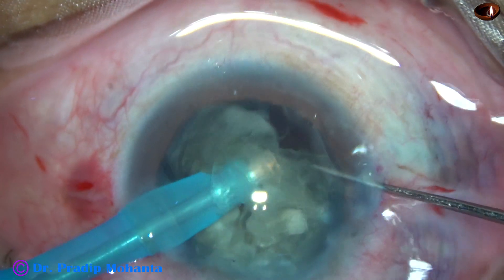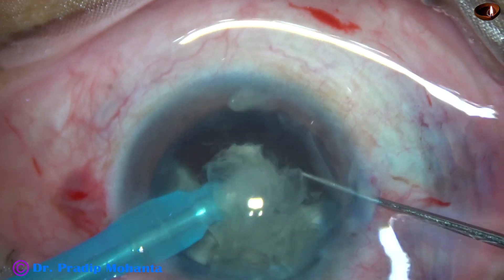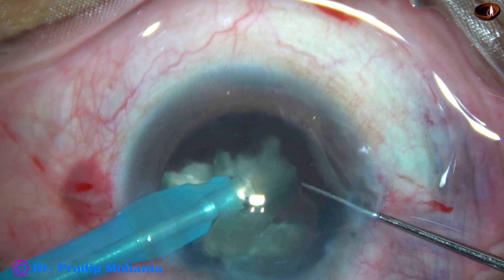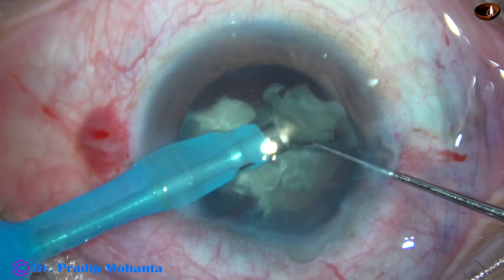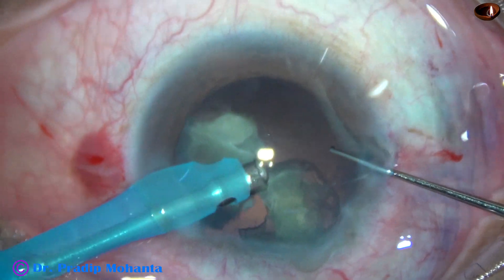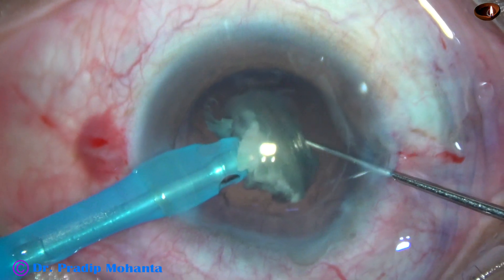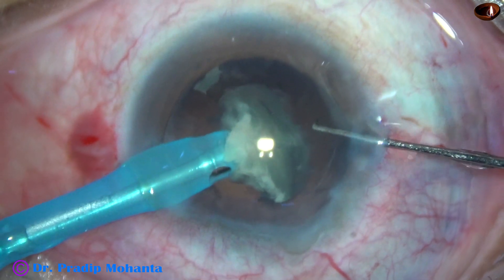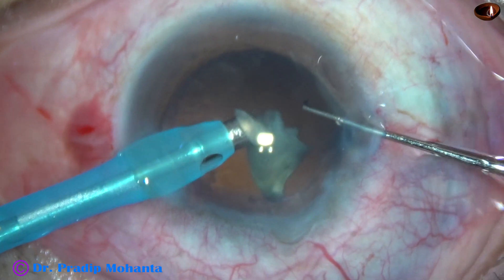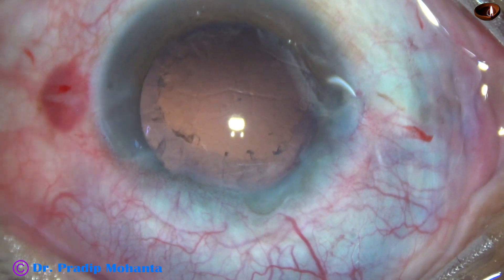Now I am going to emulsify the nuclear pieces. I am using 70% ultrasonic energy, 35 ml per minute flow rate, and 300 mmHg vacuum. Since I am doing this with my non-dominant left hand, I reduced the vacuum by 100 mmHg — I usually use 450 mmHg vacuum. In this case I am using only 300 mmHg. Flow rate I usually use 45 ml per minute; in this case I have used 35 ml per minute. The nucleus is nicely and safely managed.